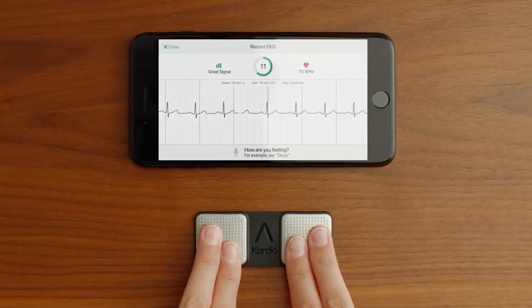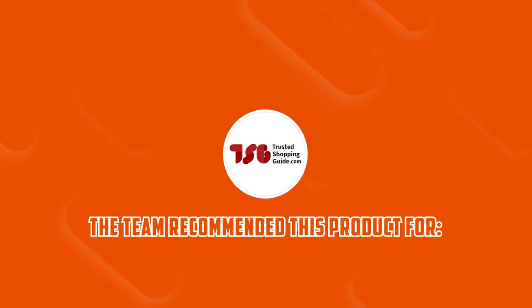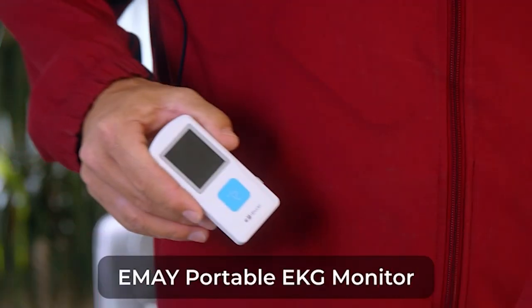Despite being user-friendly, the device doesn't have on and off buttons. But you don't have to worry, because the device should already start when it touches the electrodes. The Trusted Shopping Guide team recommends this to those who want a comfortable and durable monitor.